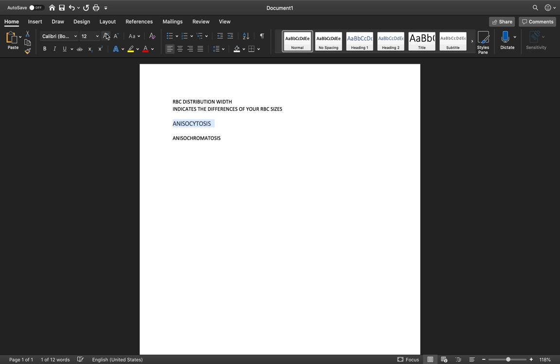Okay, so your anisocytosis, to be specific, this is what I want to really dig into before we move on. Anisocytosis is characterized as abnormal sizes of your cells. So we have large cell RBC, normal RBC, and we also have your microcytic. So in your red blood cells you have your microcytic, your macrocytic, and your normocytic, normal size cells. Okay, we also include that.